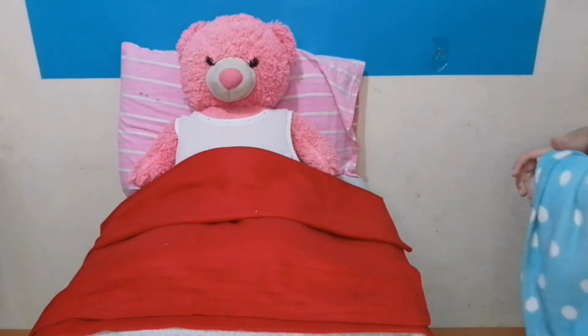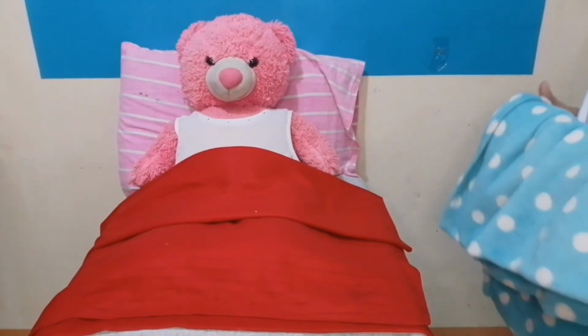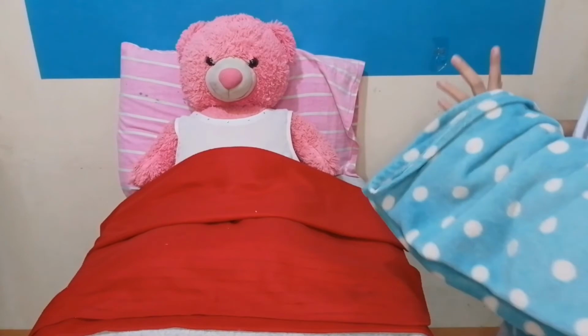After providing privacy to the client, replace the top sheet with a bath blanket. Place a waterproof underpad under the client. This protects the bed linen from moisture and from getting soiled. Sir, I'm going to change your top sheet with a bath blanket.